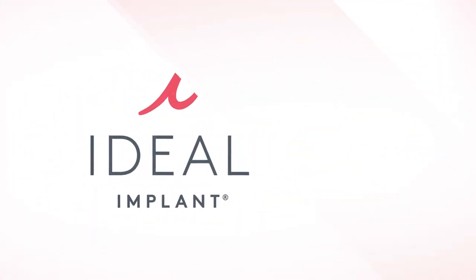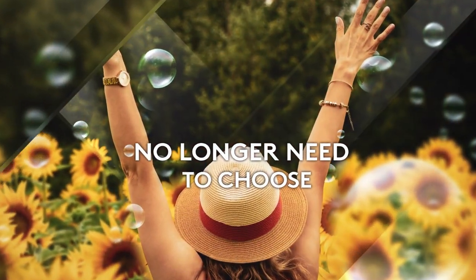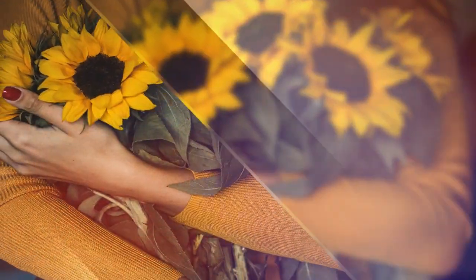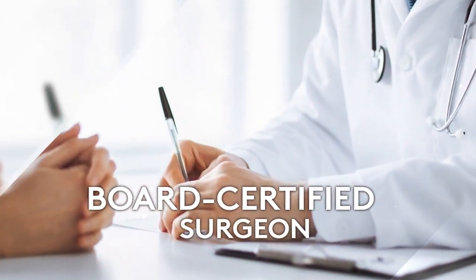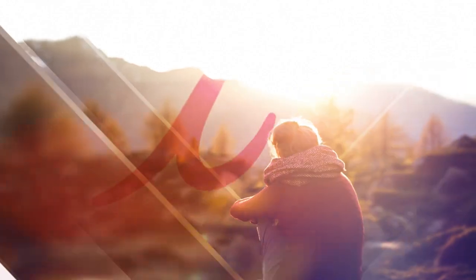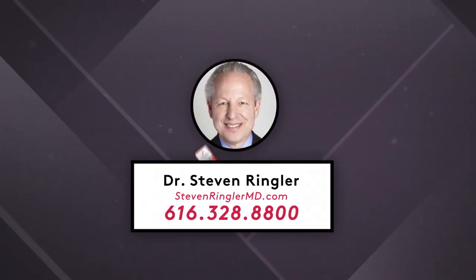With the ideal implant structured breast implant, women no longer need to choose between a beautiful look and feel and the peace of mind of knowing what is happening inside their body. So when choosing your implants, you deserve to know about all of your choices. You deserve a board-certified surgeon who offers all your options. You deserve nothing less than ideal. Ideal implant — natural feel without silent rupture.